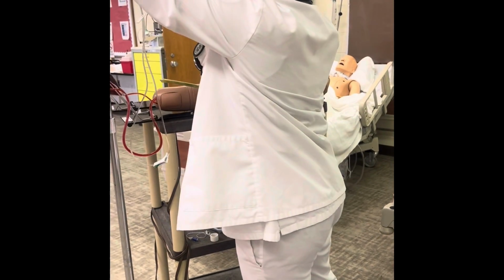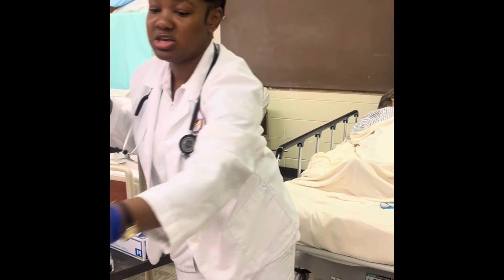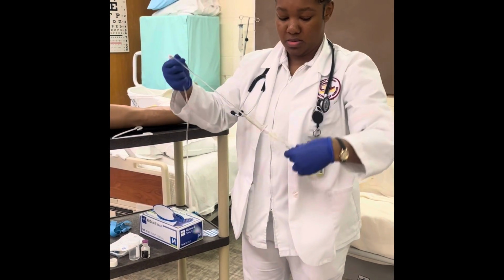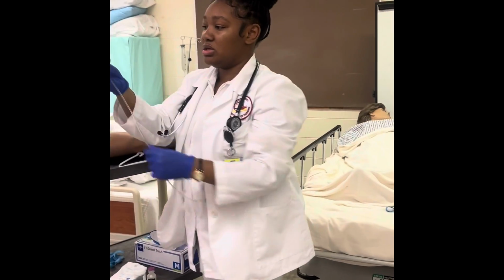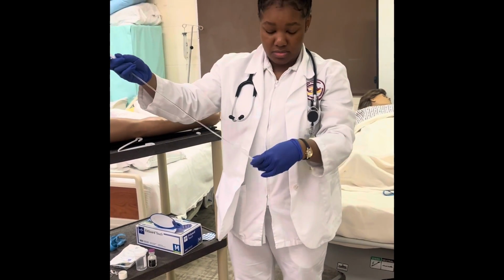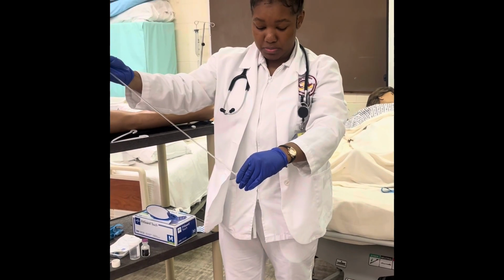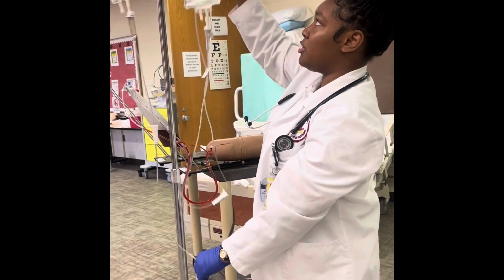Alright. And now I'm going to do my secondary line. Again, do the same thing, spike, and get it primed to get all the air out. So for piggyback, it would be a shorter tube.